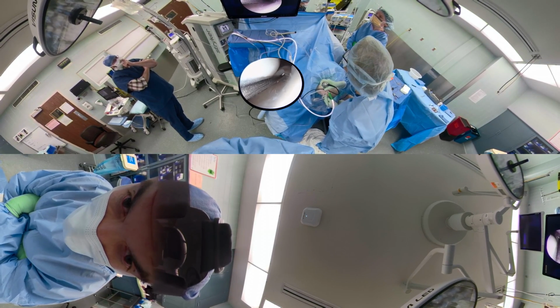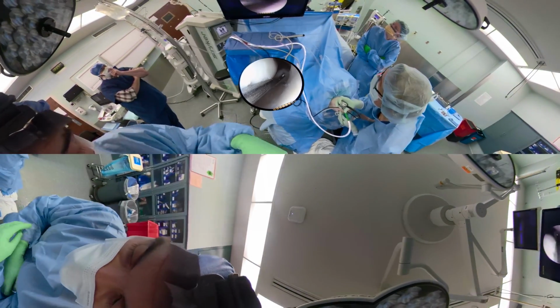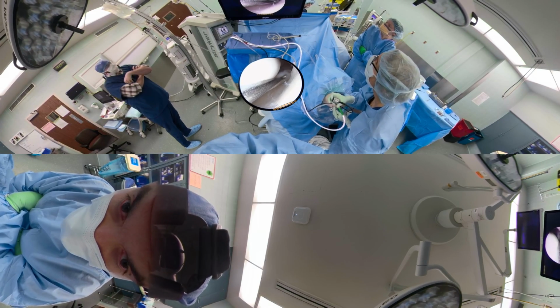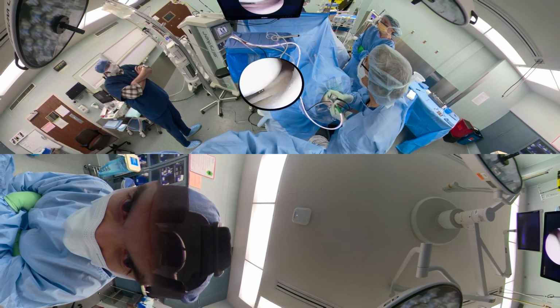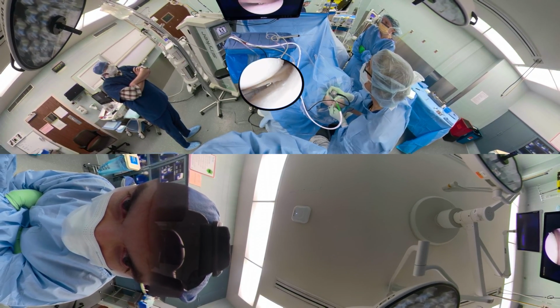So we're now looking at the tear pattern, which is a vertical tear of the posterior third of the medial meniscus. The root is intact. I'm probing it, thinking where I'm going to put my sutures. If I can put sutures both on the tibial side and the femoral side, that balances the repair a little bit better. So you can see here where the tear propagates to the tibial side.